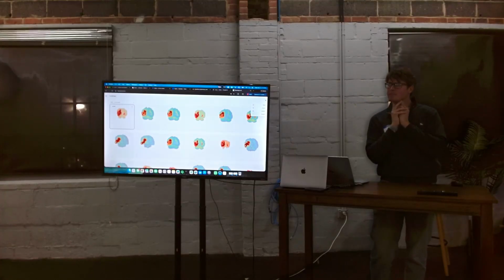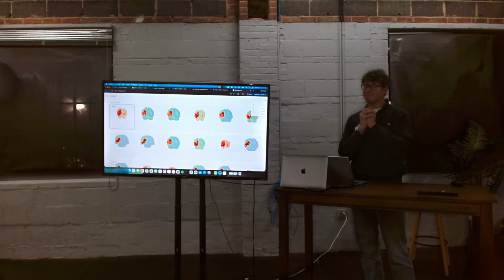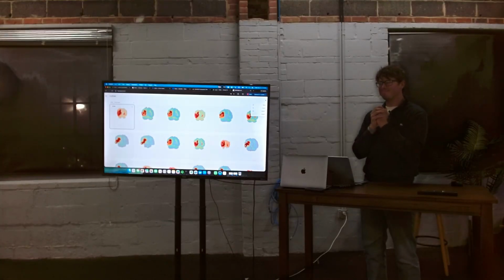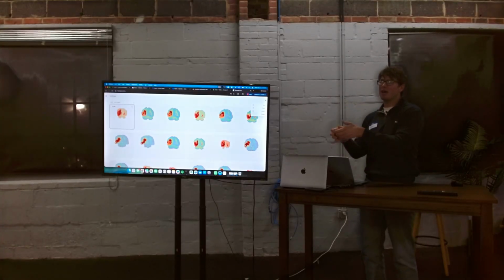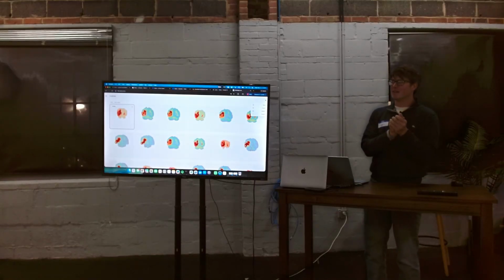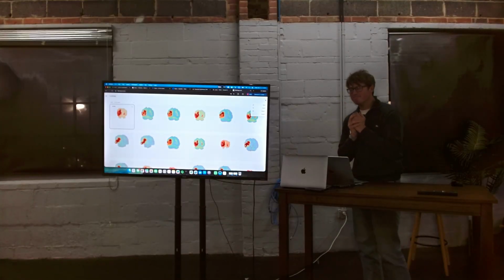SAM3 is basically a base foundation model, so this allows you to tune it for that specific scenario. Exactly. I don't have a separate web app to help you with fine-tuning that. So you would export the data and you'd have to manually fine-tune it. And as long as it satisfies the API contract and can communicate with it correctly, then you would just hook it back in.